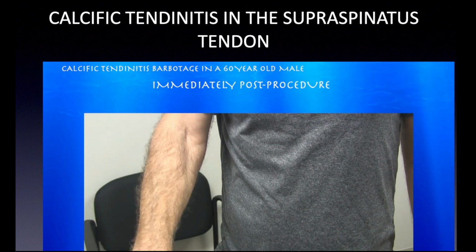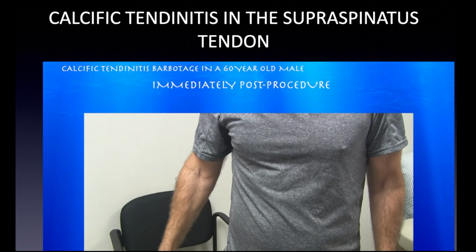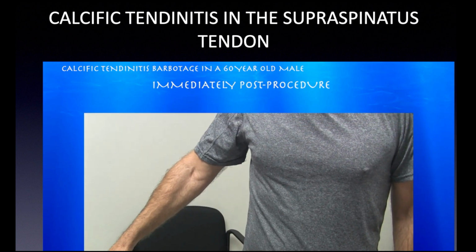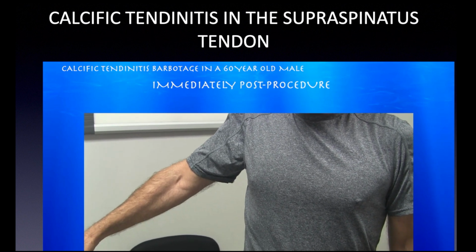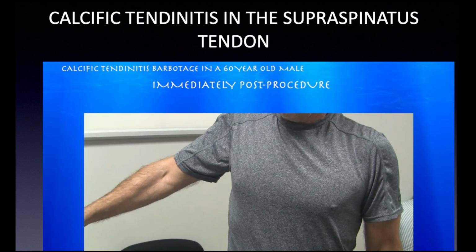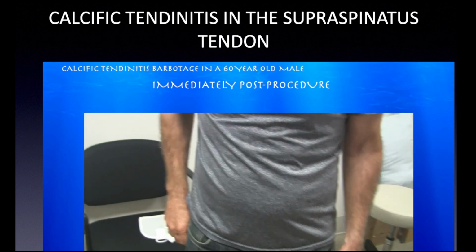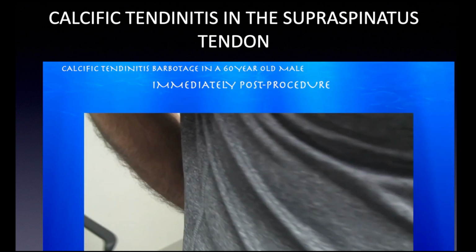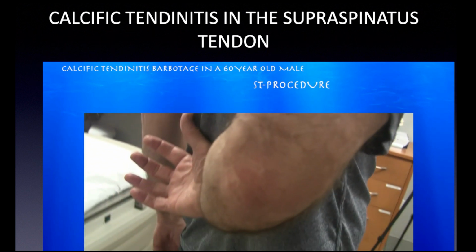Okay. Good. So he's got a 90 elbow to the side. That was hard for him. So again, he came in almost with like no motion. Okay. If I recall, this was a while ago. Okay, back down. So even that little motion is very... Can you go behind it all? That was the hardest one now. Yeah. Go all the way back. Wow. All right, good. Look at that.